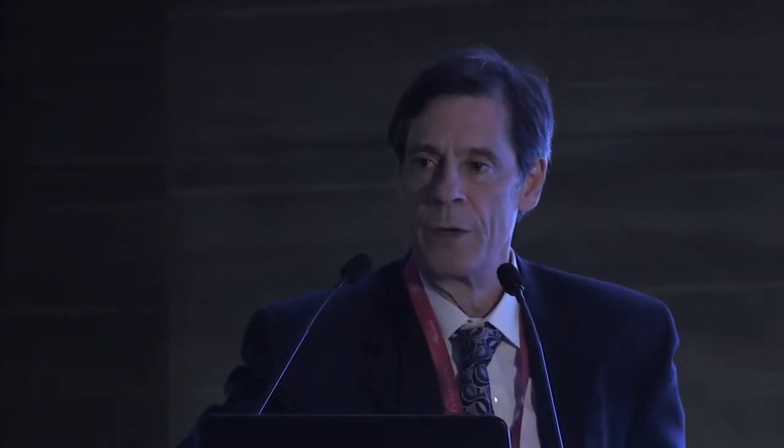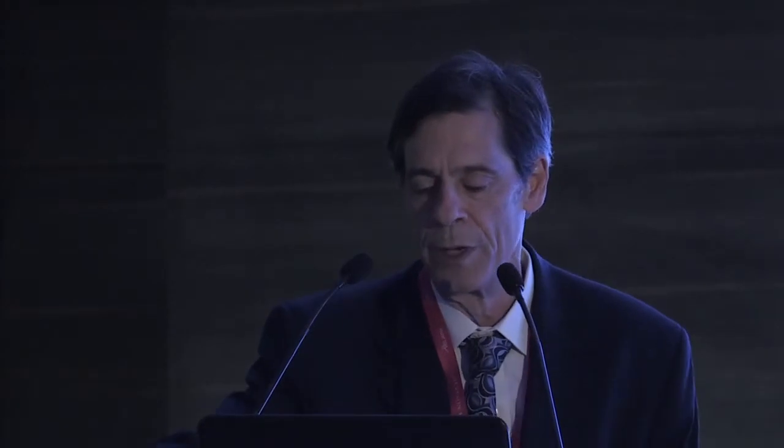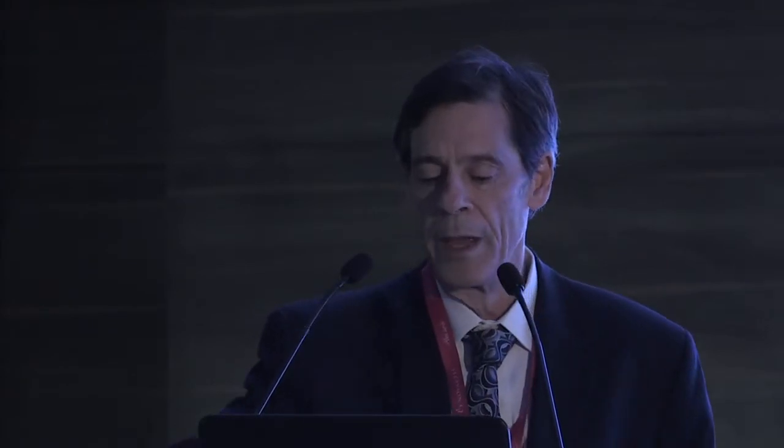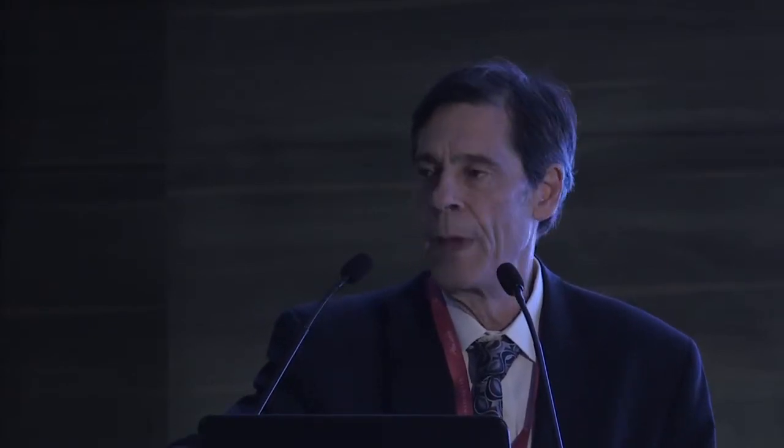As I think all of you know, in this condition, which is thought to be driven by abnormalities in Mueller cells, there are cavitations, there is disruption of the ellipsoid zone, and that disruption of the ellipsoid zone correlates with losses of function. And so in previous papers, it's been shown that if you overlay the microperimetry on top of these ellipsoid zone defects, the two correlate. But this was using manual segmentation.